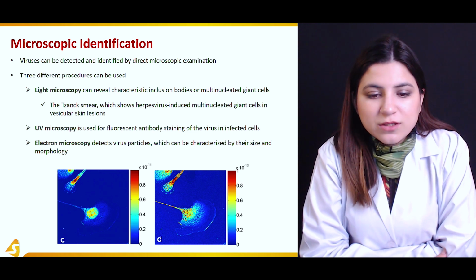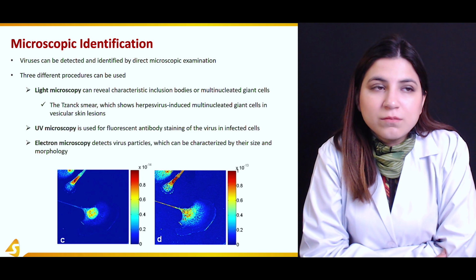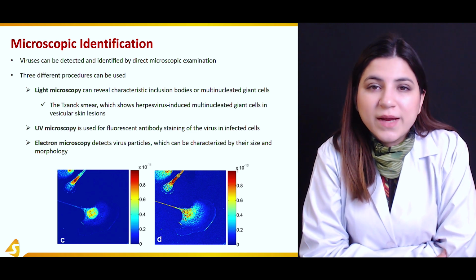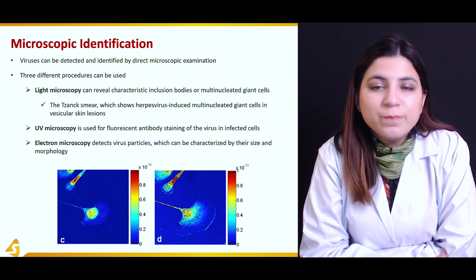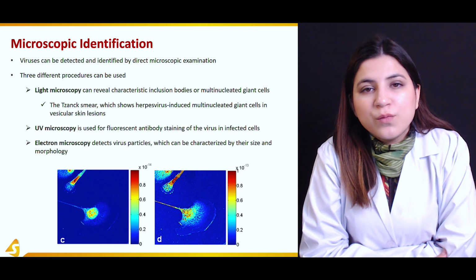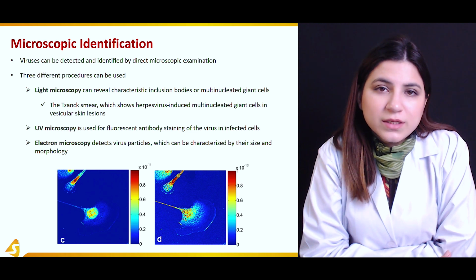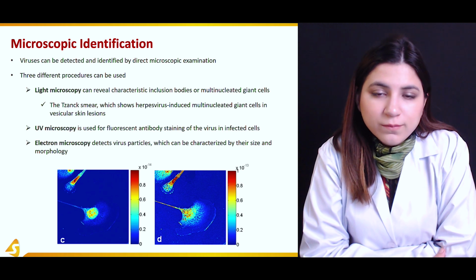As I've explained earlier, if we have an antibody which is particularly specific or homologous to the virus that might have infected a particular cell, then by adding those antibodies in that sample, we can detect the signal, the fluorescent signal that is given out once the antibody antigen complex is formed.